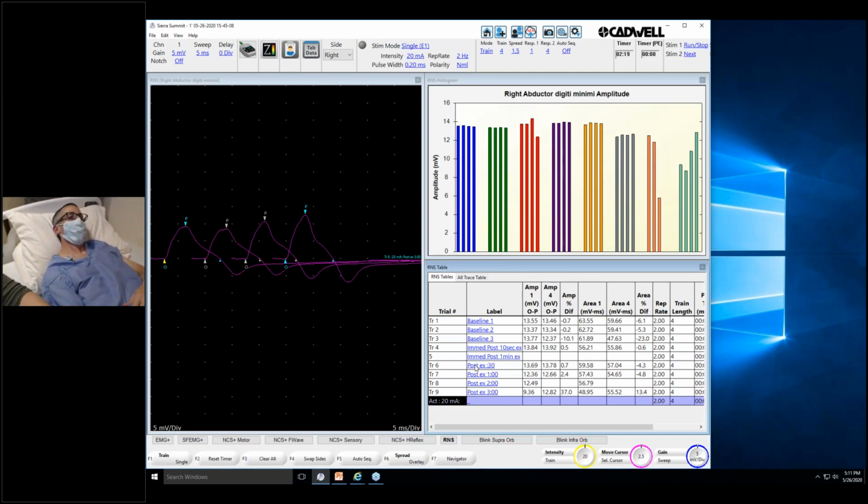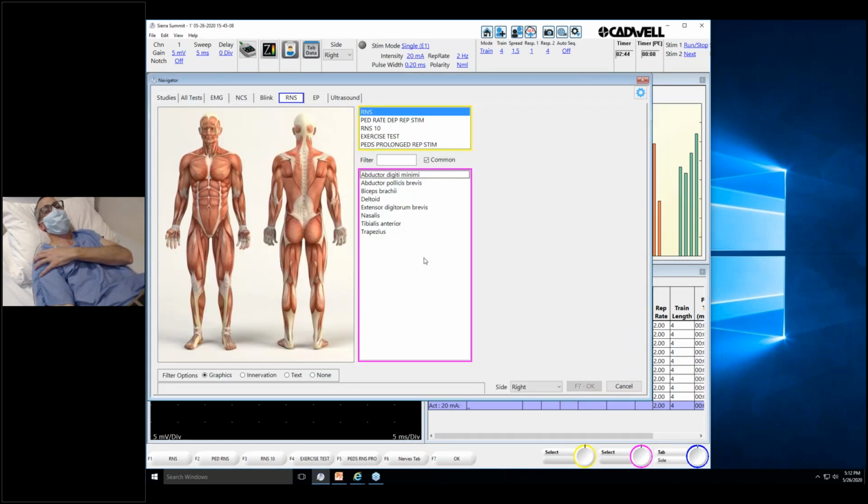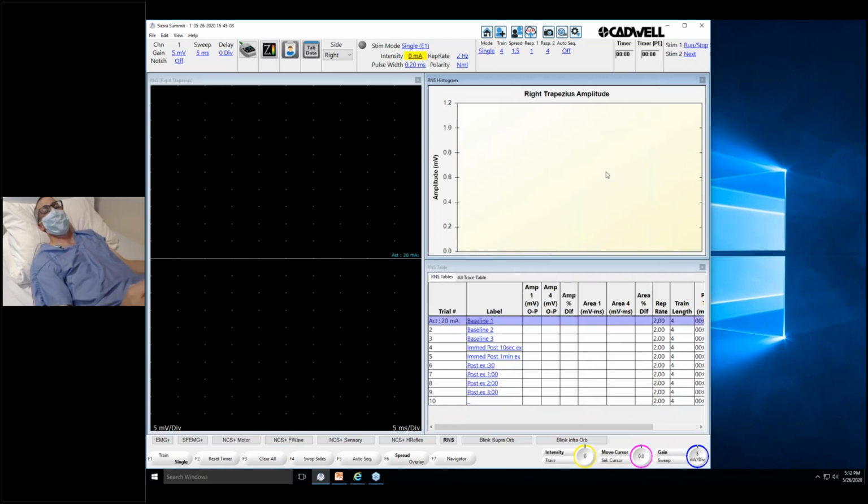Thank you. So the spinal accessory nerve is actually a fairly easy nerve to stimulate. If you don't do these very often, it doesn't require much current. The nerve is superficial, so it doesn't hurt that much. It shouldn't require a ton of stimuli. I think what's hard about rep stim is that it's hard to stabilize that muscle. And we're going to show you what we're going to do. Jennifer's going to do baselines, and then I'll exercise.